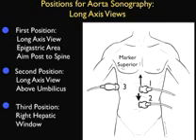This will image the most superior part of the aorta, and you'll be able to see the celiac axis and the superior mesenteric artery. One can then move the probe down to probe position 2, sliding it down to the area above the umbilicus to image the full extent of the aorta in the long axis configuration. At about the level of probe position 2 is going to be about the level of the bifurcation into the iliac arteries. So this should complete our examination of the aorta.